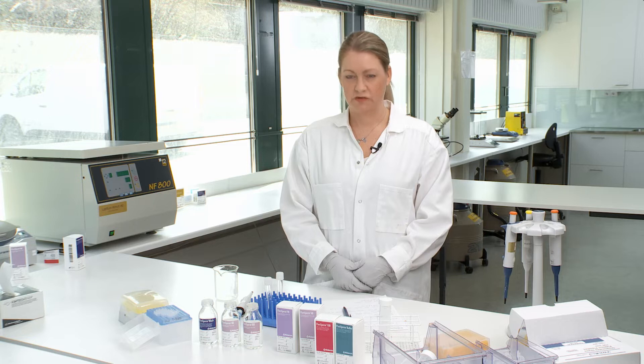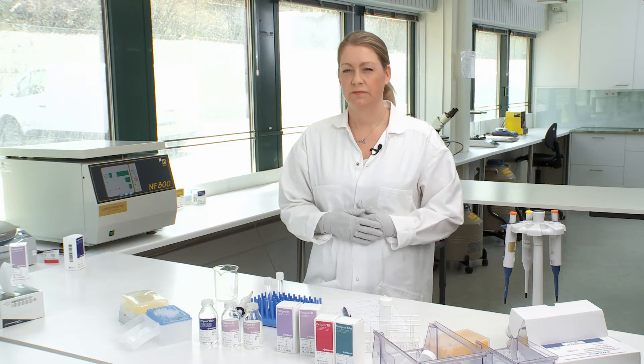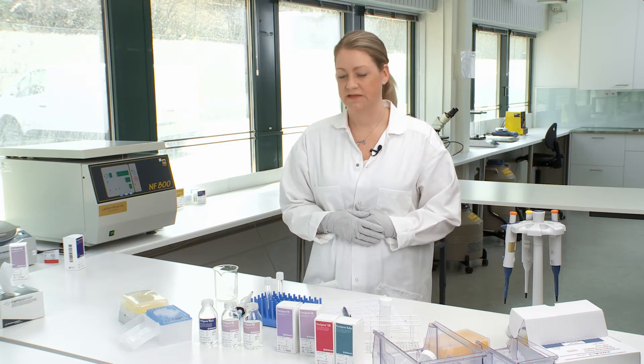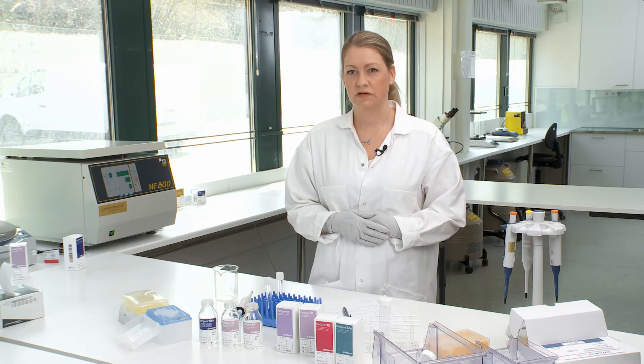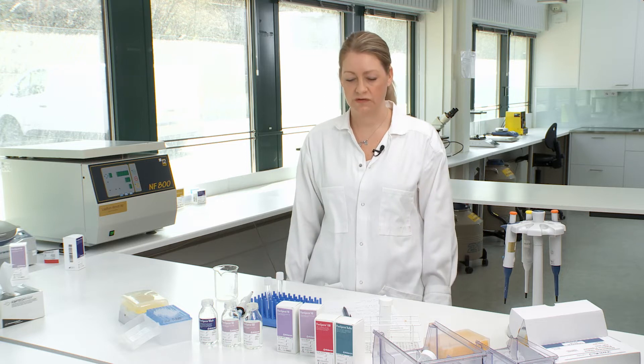Today we are doing a short instruction on how to prepare density gradient centrifugation. We have a few alternatives that you can use depending on the treatment that you're using.